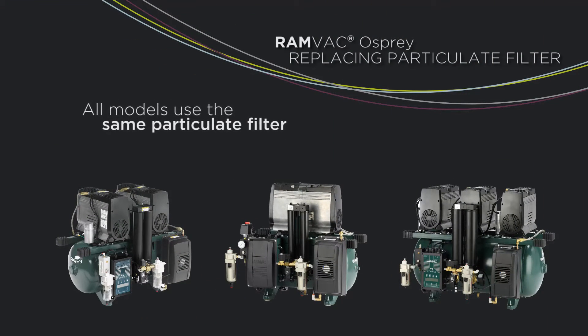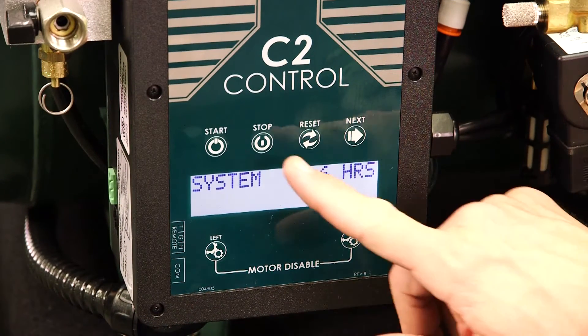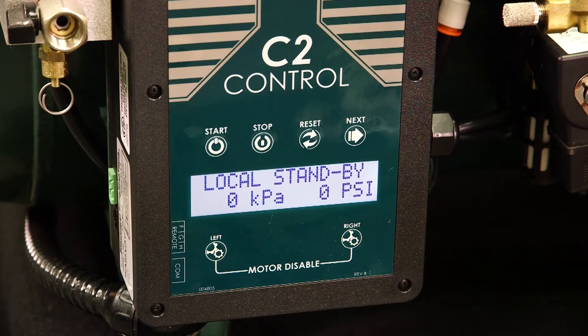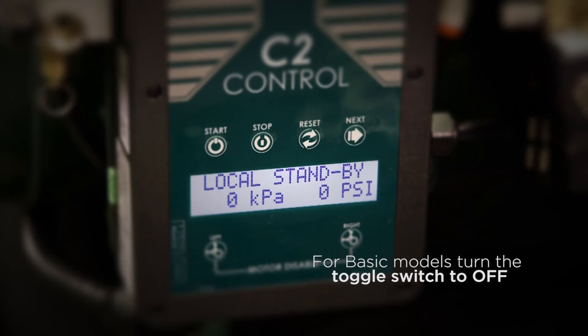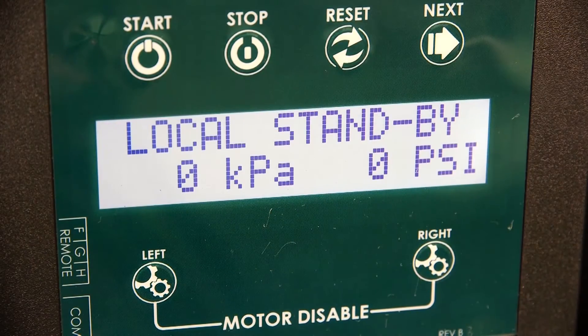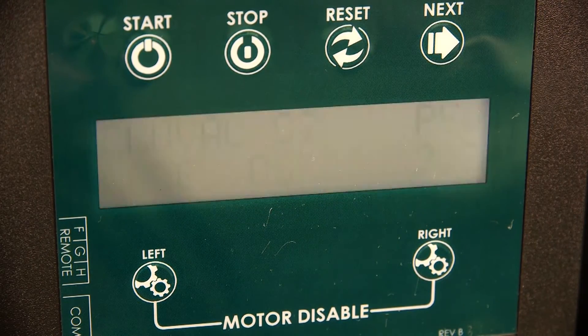Please note, all models use the same particulate filter. To replace the particulate filter, start by turning the compressor off. For smart models, use the stop button on the C2 control. For basic models, use the toggle switch to power down. The next step is to unplug the compressor to remove power.